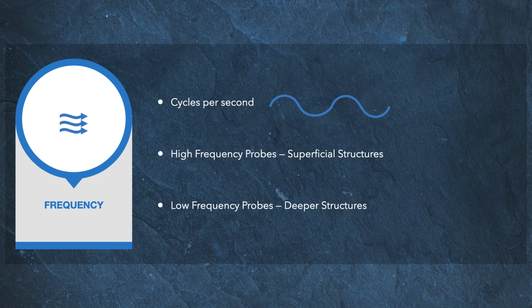With that in mind, however, there may be occasions in which a high-frequency probe provides insufficient depth to see the structure of interest. In those cases, the lower frequency probe may be used for shoulder, hip, and DVT ultrasound.